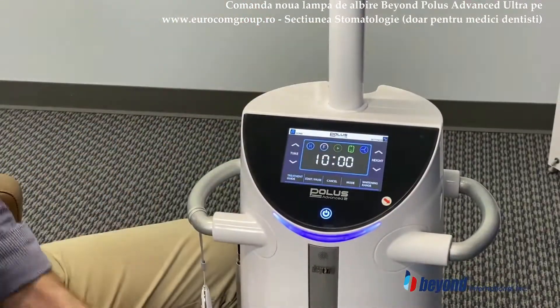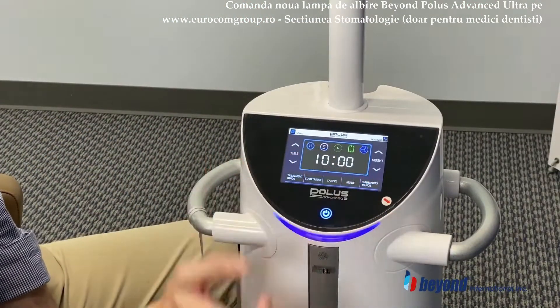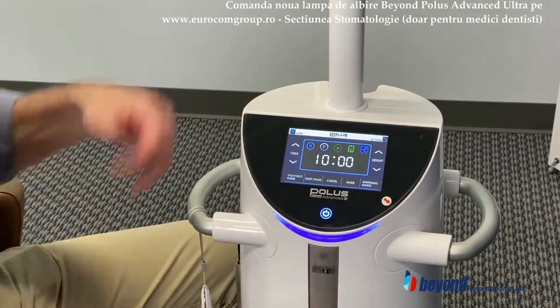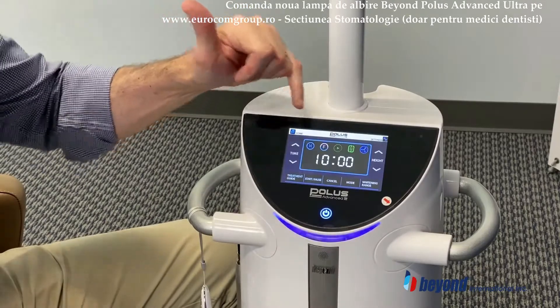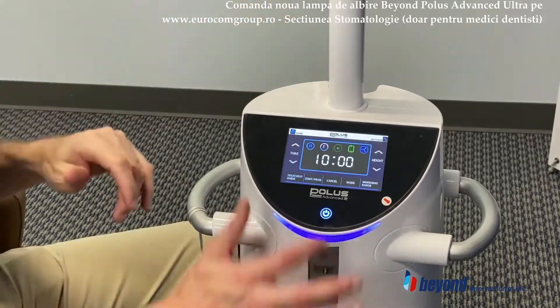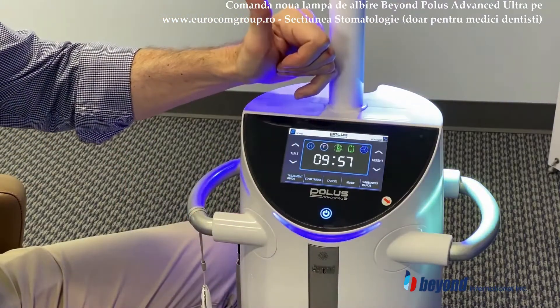This F denotes full arch. Your other option will be S for single tooth function. This is for your ultrasound. The only way you'll be able to tell the ultrasound is working is when you activate the unit — I'm going to activate it to show you. And you can see the ultrasound is now activated.